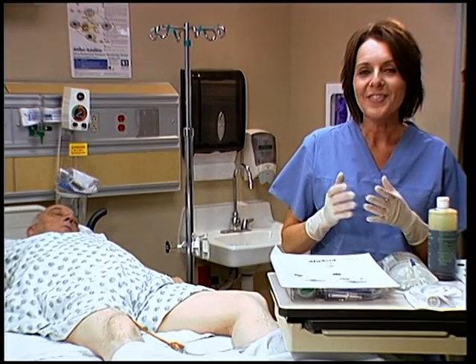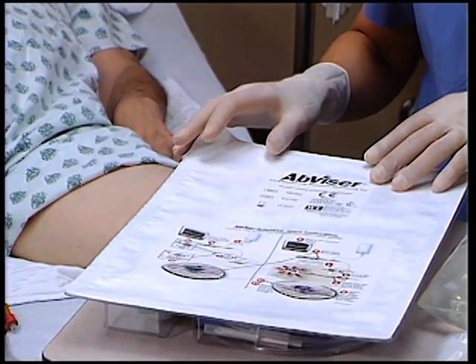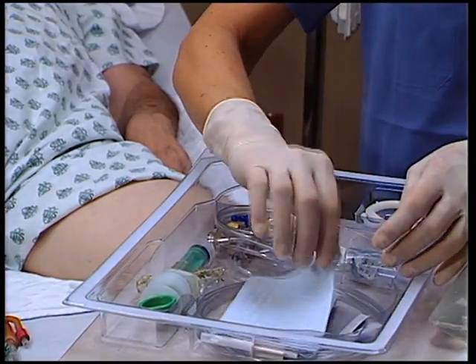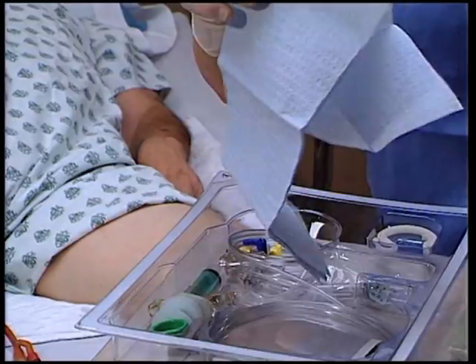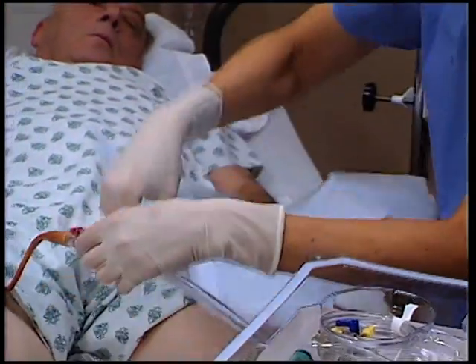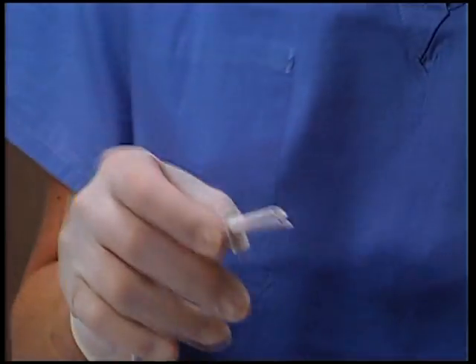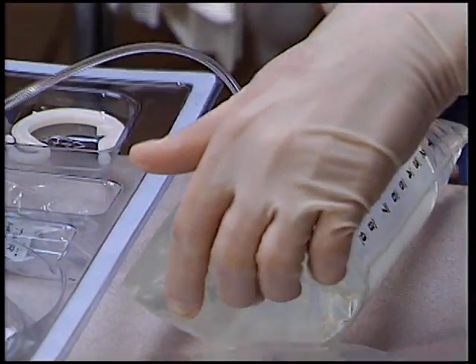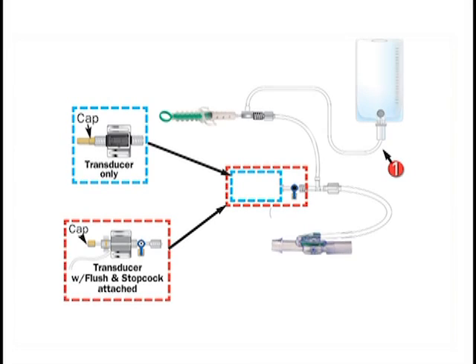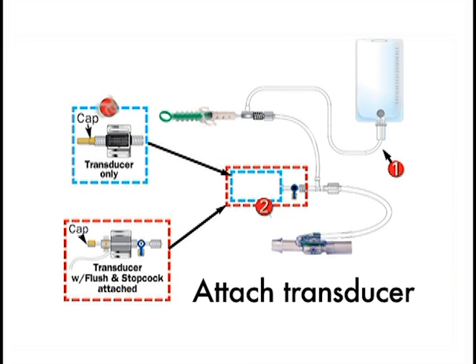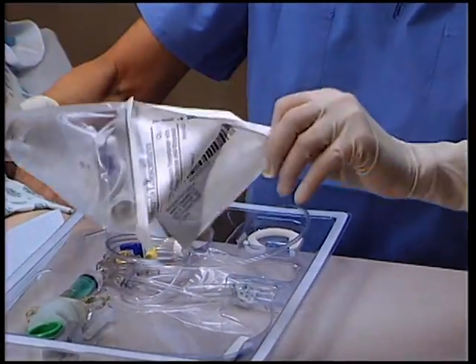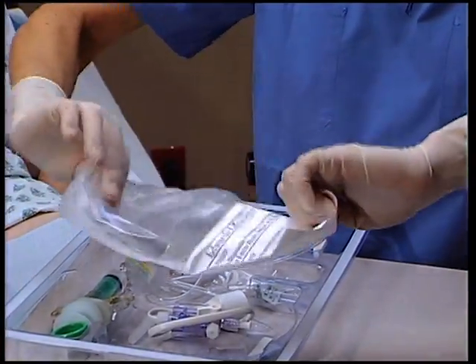The first steps can be done using clean gloves. Open the kit by removing the protective Tyvek lid. Remove the blue sterile drape and place it under the Foley connection. Take the saline spike from the kit, remove the protective spike cover, and spike a saline bag. Peel open your transducer kit and drop it onto the tray. Prep the Foley connection with antiseptic solution.